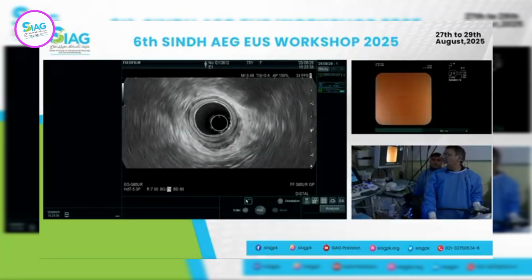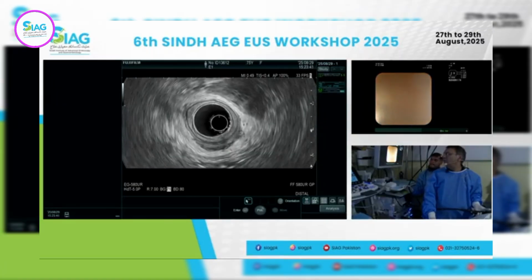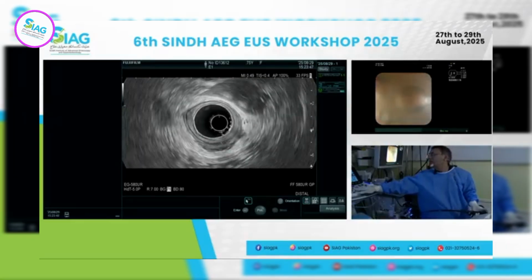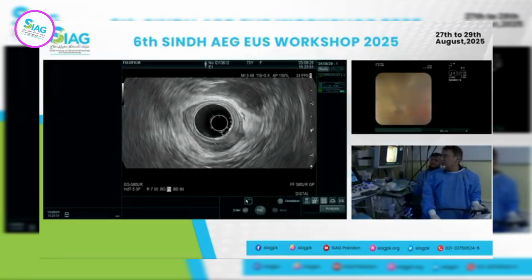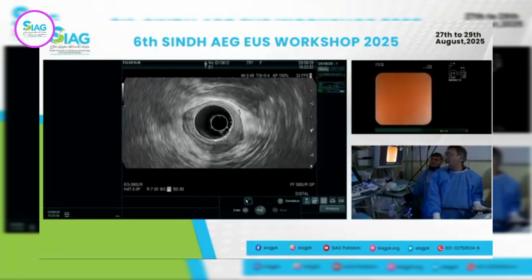And the other thing I'm saying is that it's likely wall thickening and inflammation around. The muscularis propria is quite intact there, and there is some inflammation around that area. But if you look at the muscle itself, it's quite nicely intact right there, all around, even all the way up here. So I'll pull that back a little bit.